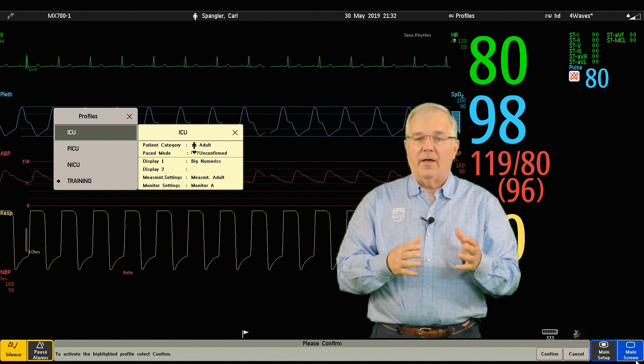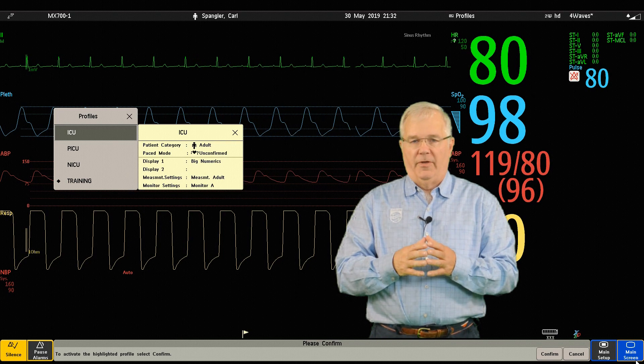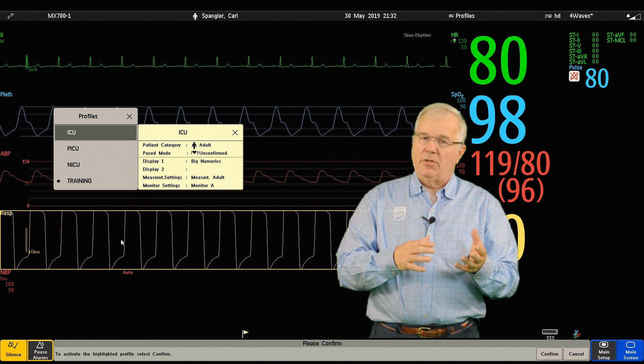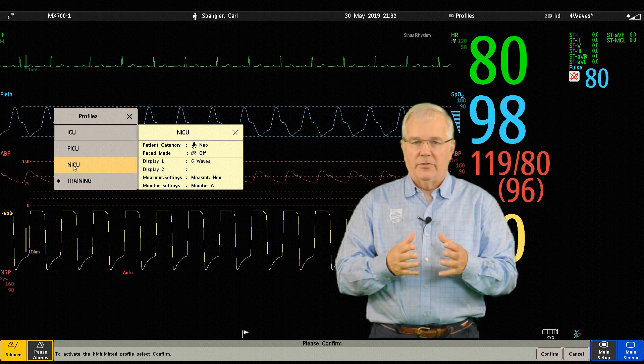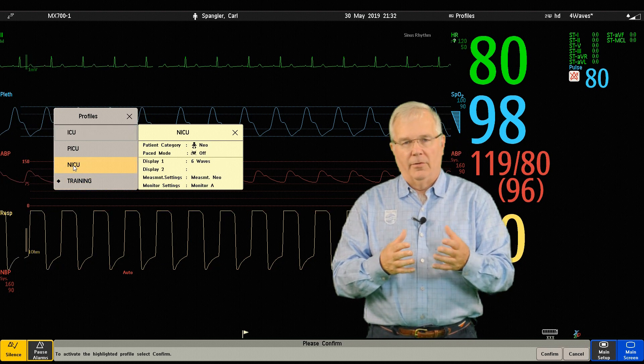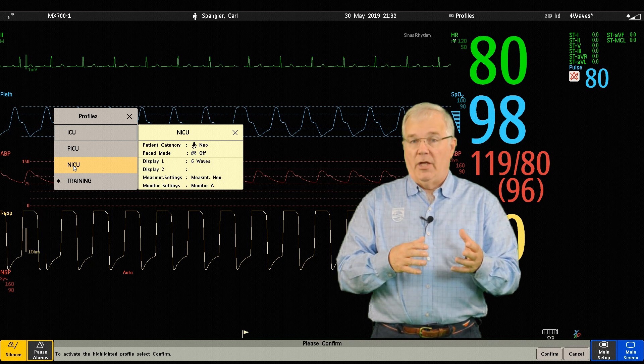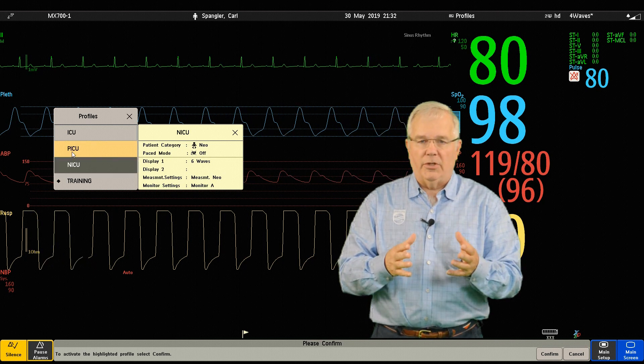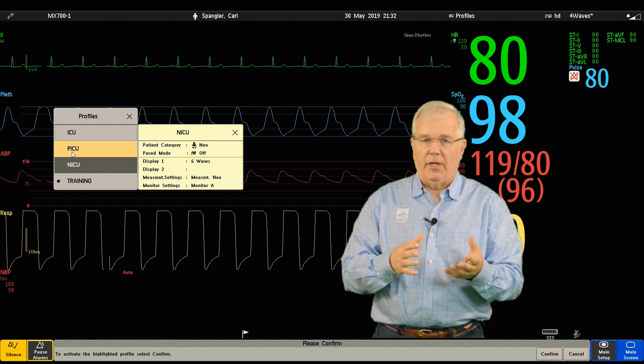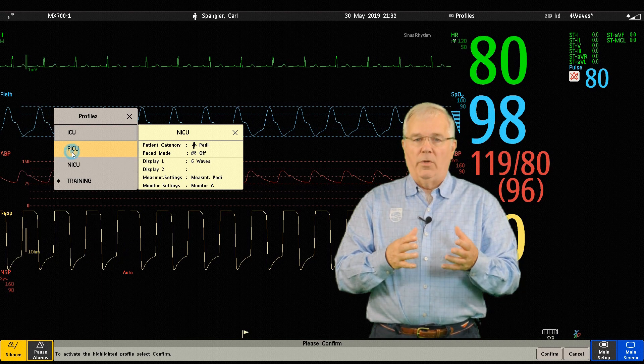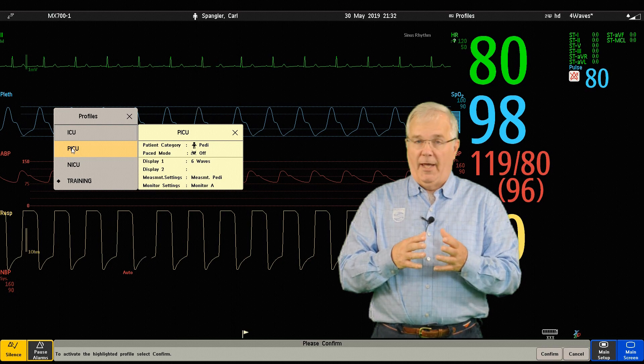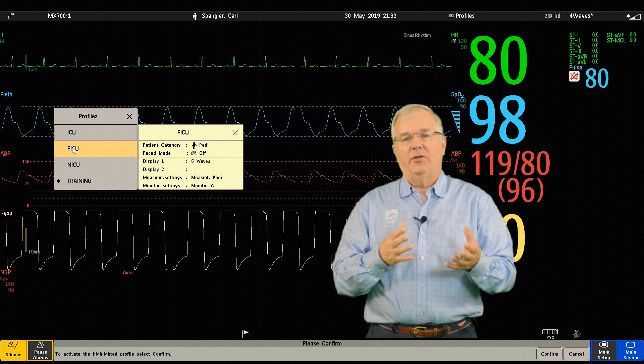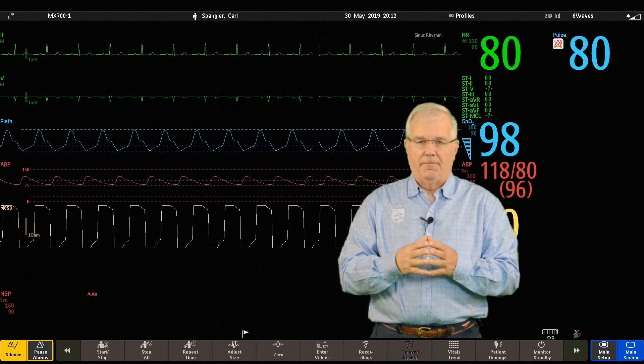Well, profiles are predefined monitor configurations and they let you change the configuration of the whole monitor so that you can adapt it to different monitoring situations. Now the changes that occur when you change a complete profile are far more reaching than those made when you just change a screen. Screens only affect what's shown on the display and profiles affect all monitor and measurement settings.